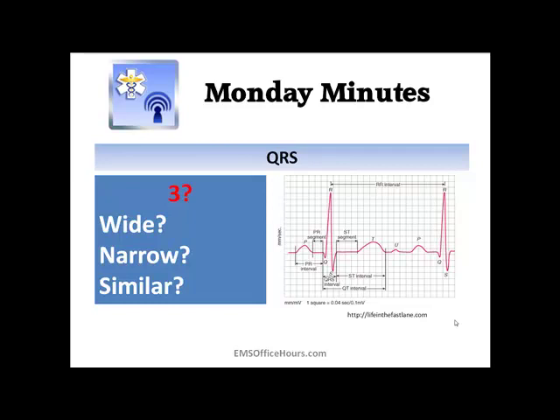The third thing is: is the QRS complex similar in appearance across the entire EKG strip? Those are the three key things for your QRS. Of course there's much more you can look at — the J point, the R wave, the Q wave, the segments between the P and the R. But in Monday Minutes I'm focusing on the basics: if you see a wide or narrow QRS, start looking at other things. Does every QRS look the same? Do you have a P wave before each QRS?